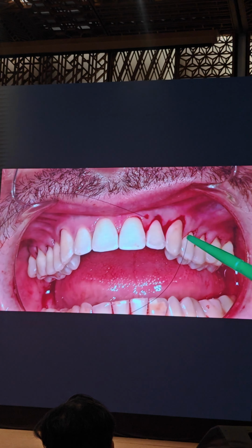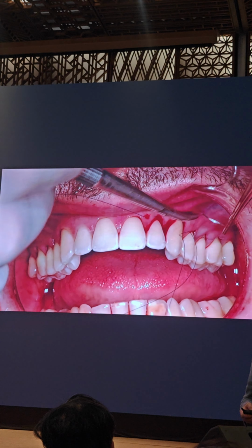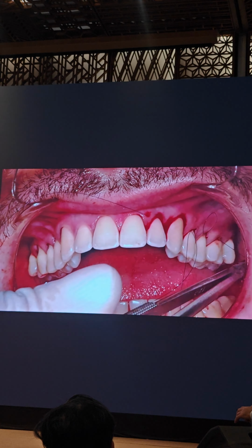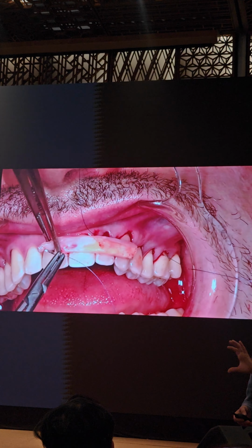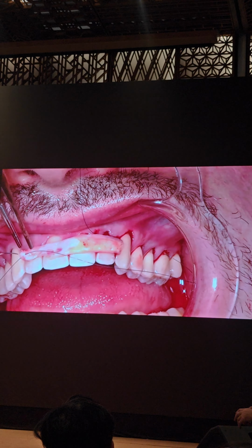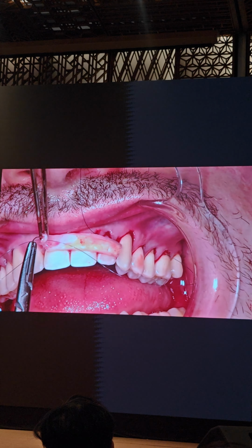So you go from one side to the other of the tunnel, being sure that you have chosen the biggest recession to get the tissue inside. So in this case, the biggest recession is the last tooth distally. If it had been the opposite, the suture would have been reversed. The important thing is, where is the biggest recession? So this is a U.